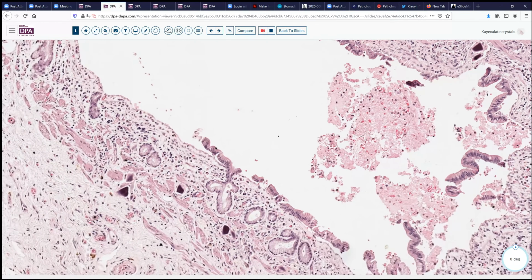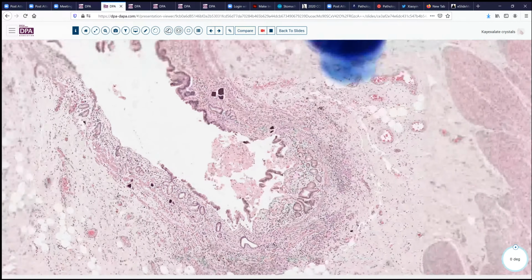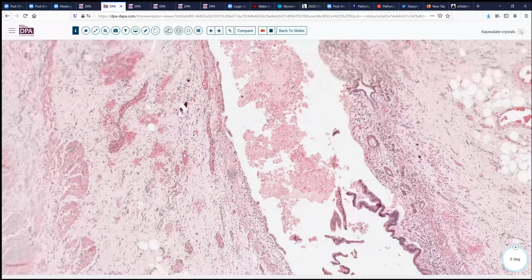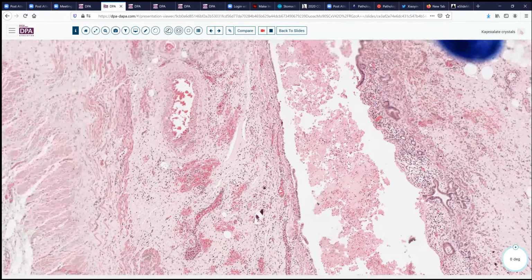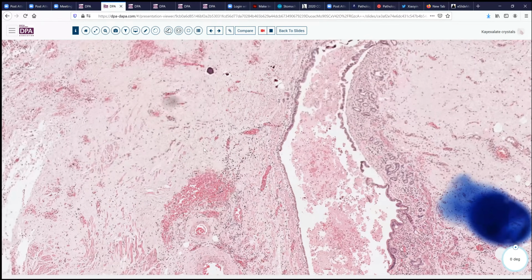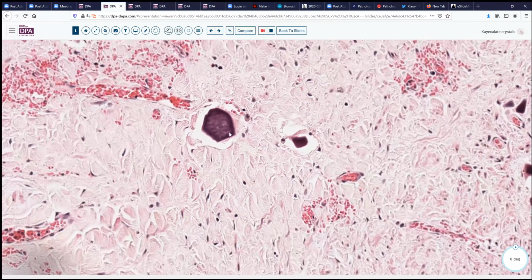Also present over here, out into the muscularis. So you know there's been damage that's exposed them to potential ingestion. And up here, we can see that they're out again in the lamina propria, submucosa, and here again up here with this appearance. And again, you see the nice zonation.